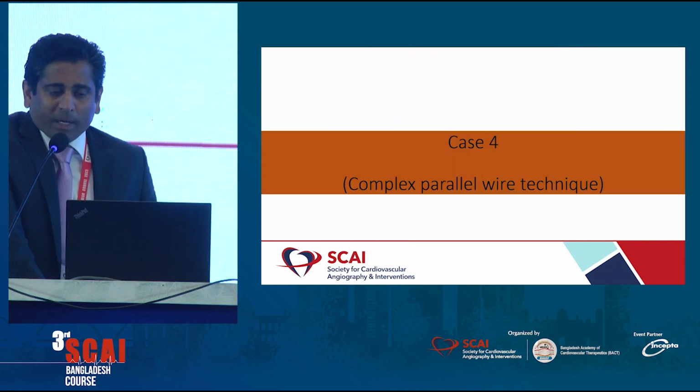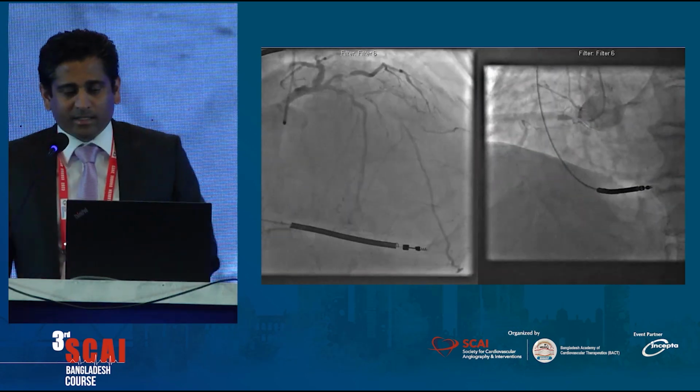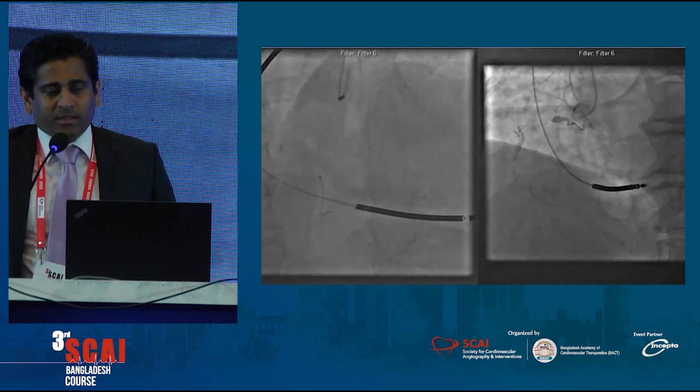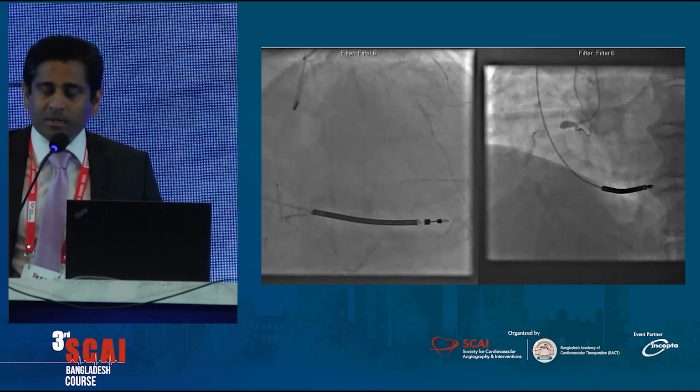So I'll show you a slightly complex case. This is a complex parallel wire technique. This patient, as the previous speaker mentioned, had severely impaired LV function, got an ICD in place, blocked LAD, blocked right coronary artery, extremely symptomatic.